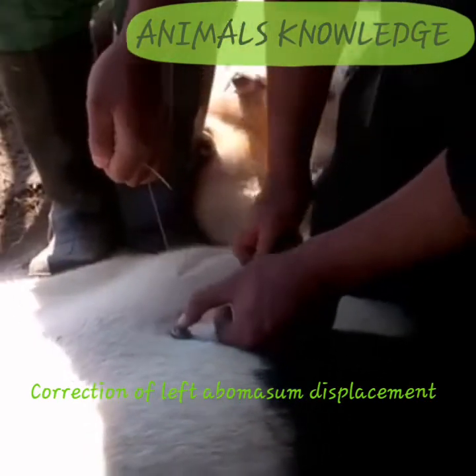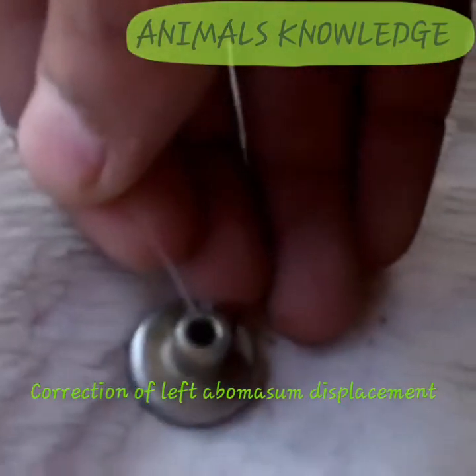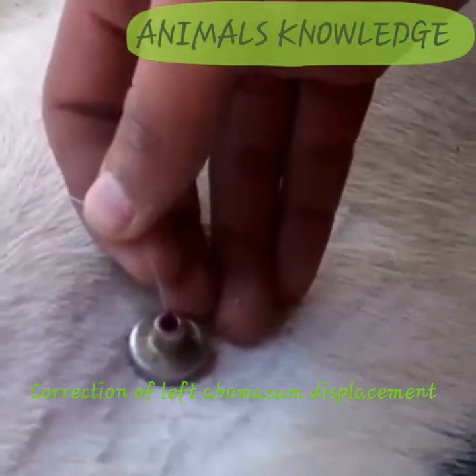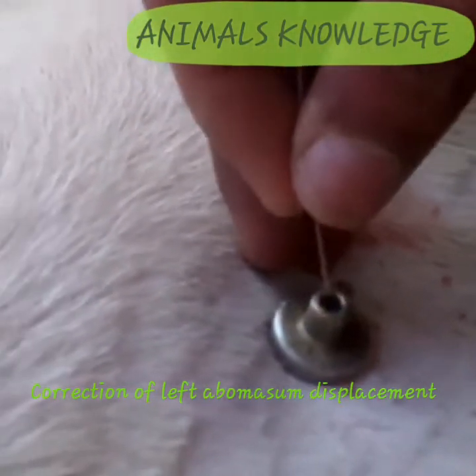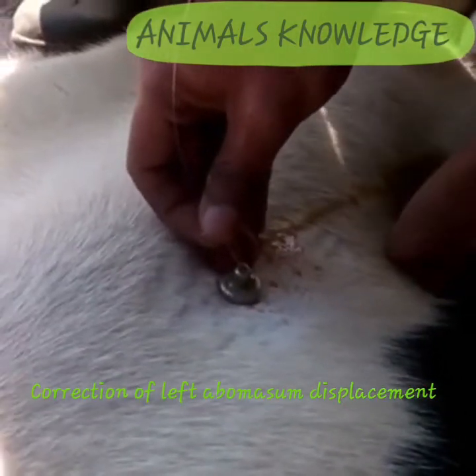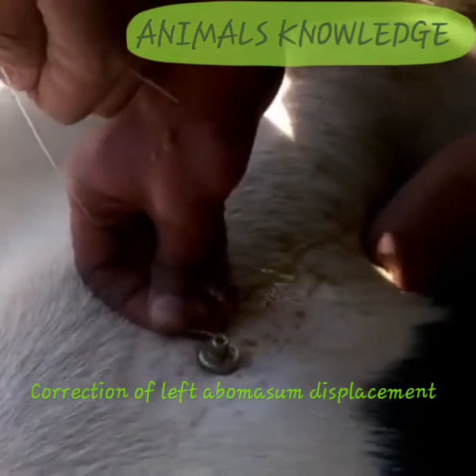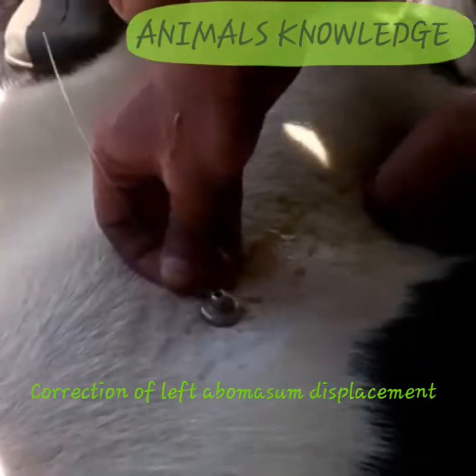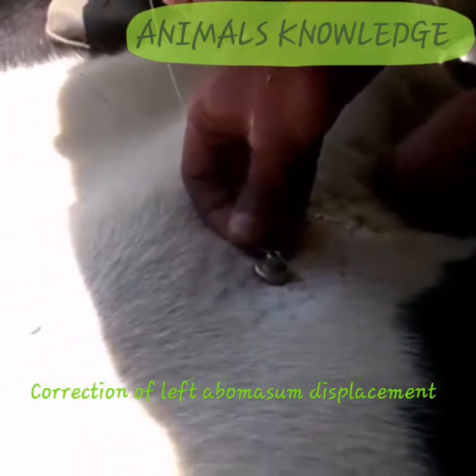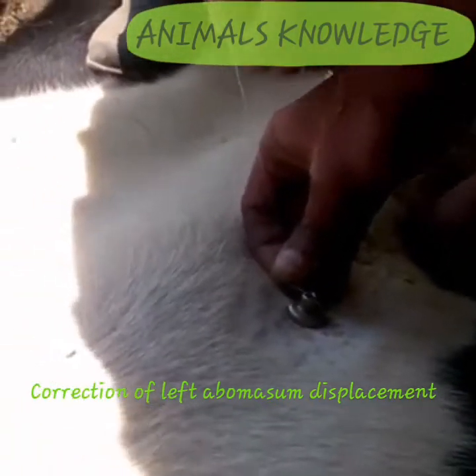I have applied both sutures. Now I will completely remove the air from the abomasum. You can also see the liquid oozing outside from the abomasum. You can also check the pH of this fluid coming out to make sure that your toggle is just inside the abomasum or not.